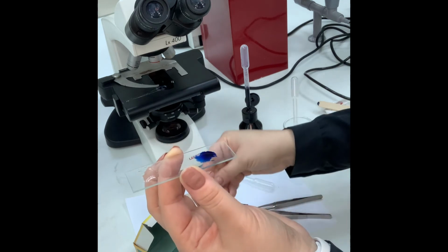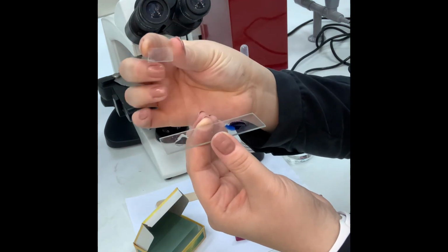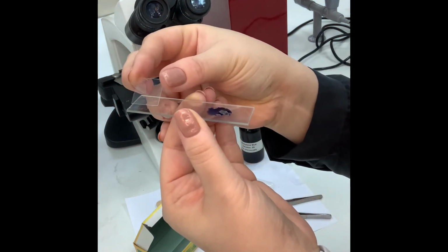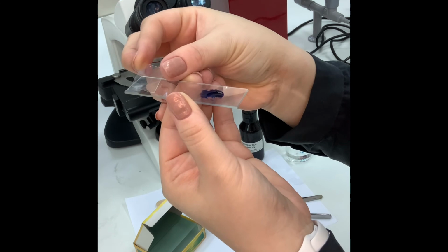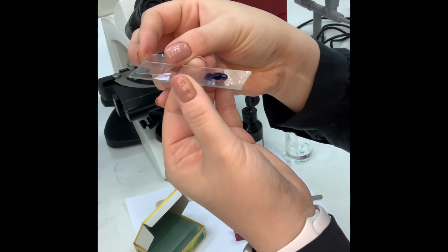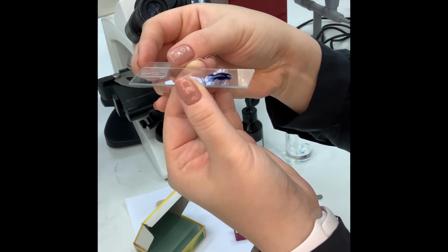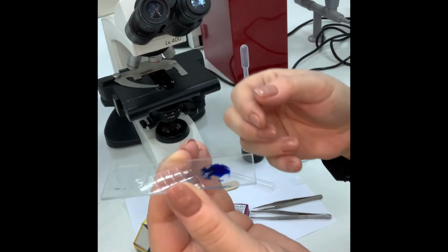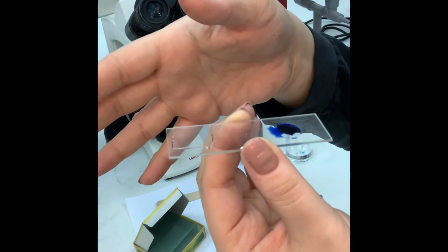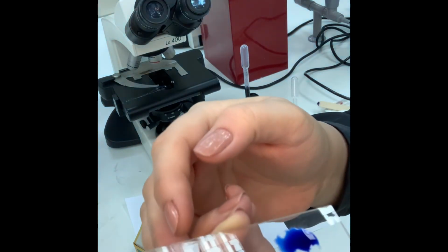Now, when I apply the slide, I should tilt, keep it on the side over here. Can you see it? I should just tilt it. And very slowly, very slowly, very slowly, I will apply it. Now, why slowly? I don't want to just drop it, because if you drop it, you'll create air bubbles. Look over here.